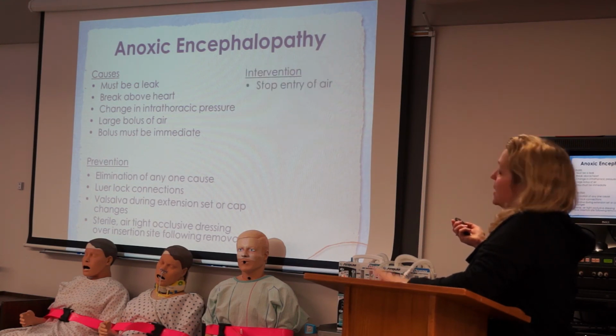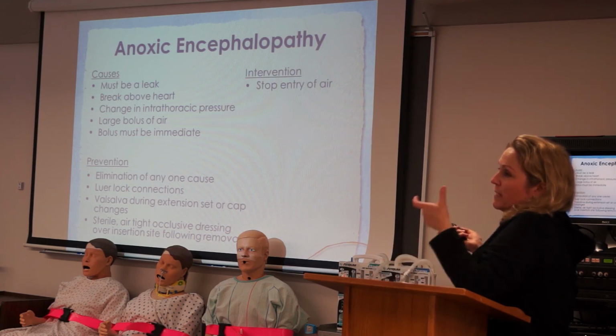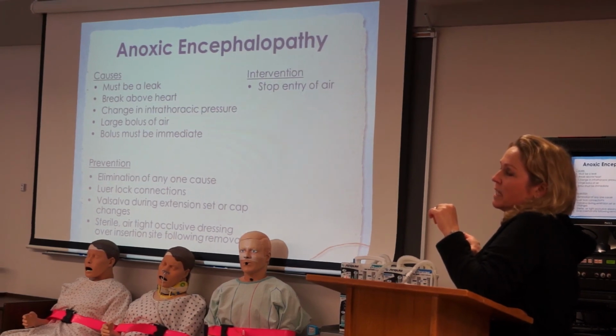When you are removing these lines, do you remember the dressing you used for the chest tube? What was that? The Vaseline. Same thing you use for central lines. Not PICC lines, but for central lines, when you're removing them, we use Vaseline gauze to cover the entry site.